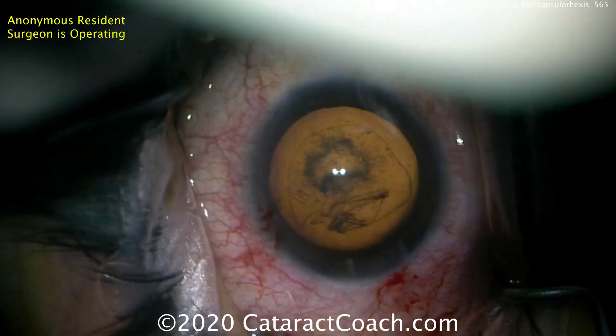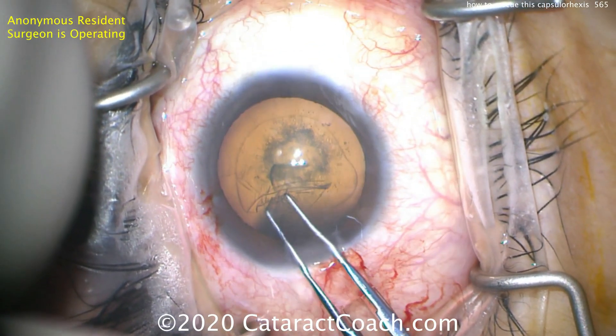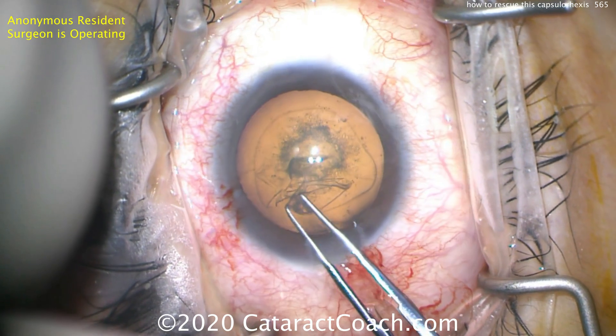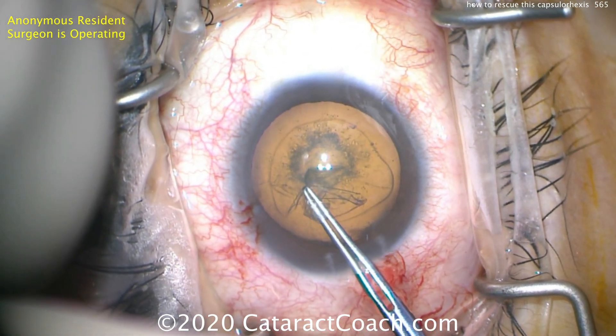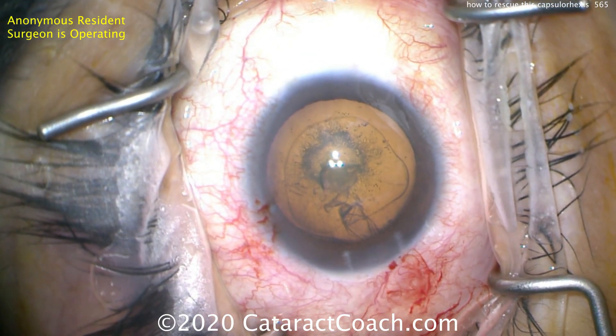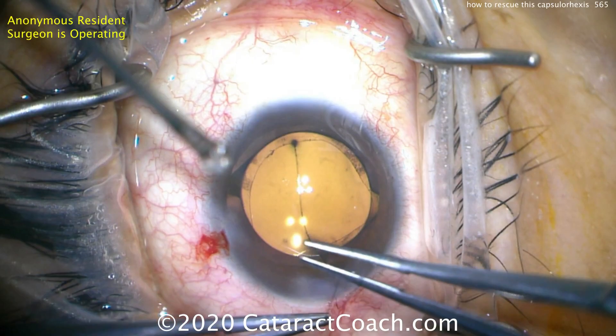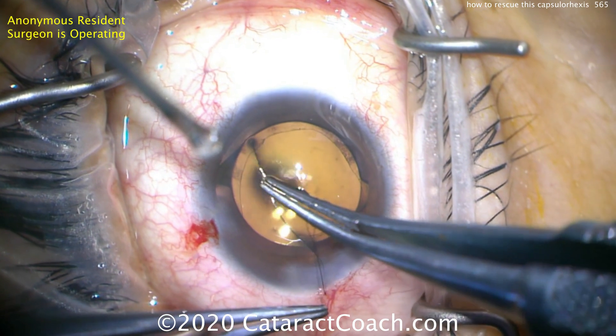It runs out again. So it's important to be able to rescue this, and we're going to use that little technique one more time: grabbing the capsule edge here, pulling backwards, and then continuing to get it complete. Bringing it in — there it is — and it can be completed. Looks okay, not terrible at the end of the case.